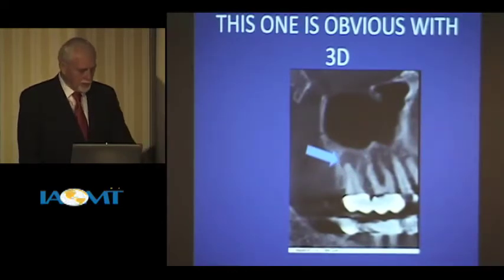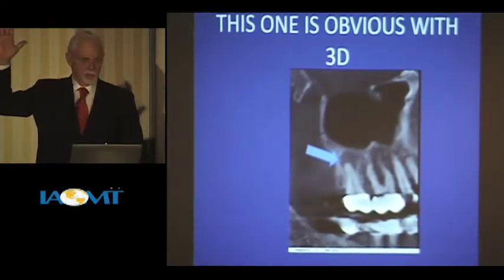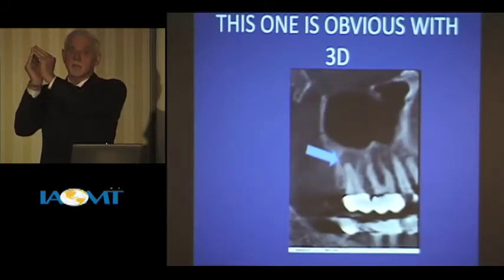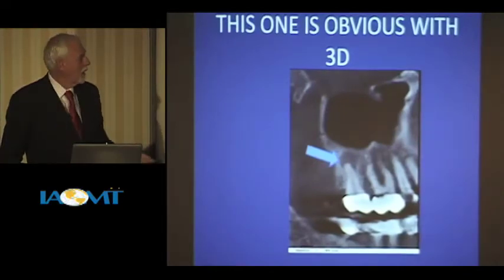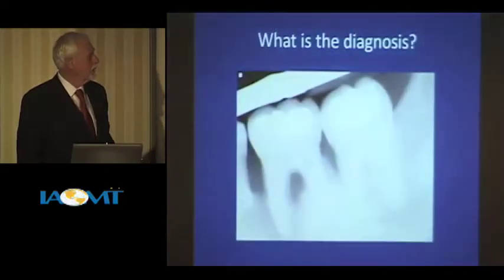What I sometimes tell patients when I'm going over the CAT scan, I say, let's pretend that this hand is the root of your tooth, and this is bone. It ought to look like this. If it looks like this, something caused that. And that's what we see a lot of times. This is a little bigger than what I would see without picking it up on the other film, but it does happen.